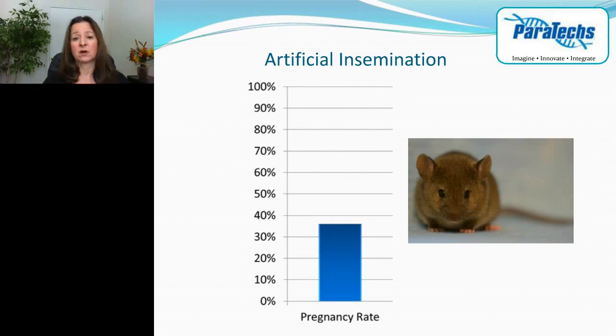If you are going to try something like that, make sure that the animal is indeed 2.5 days pseudopregnant. The opening of the cervix has to be dilated in order for the NSET device to pass through, so if you try to do this without having the animal dilated first, it won't work.